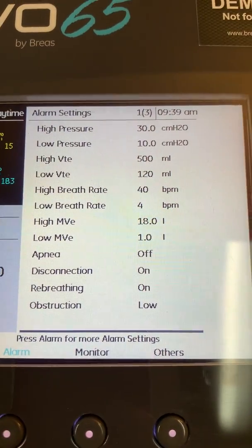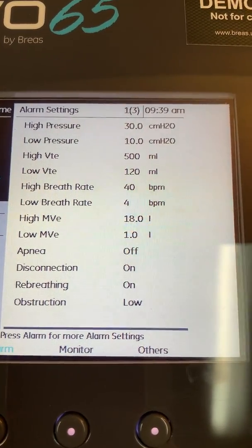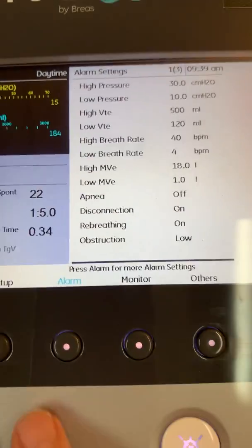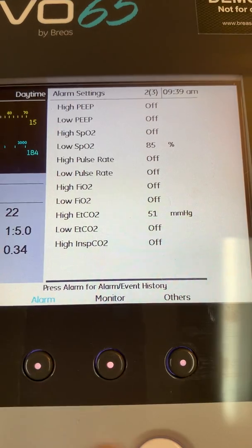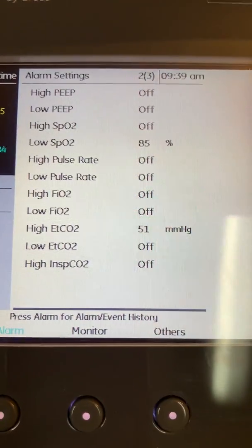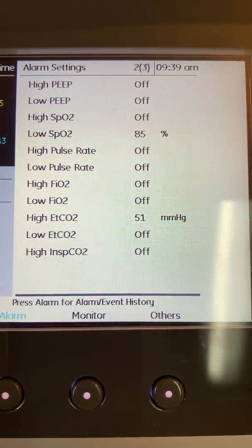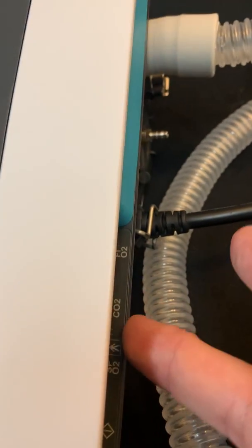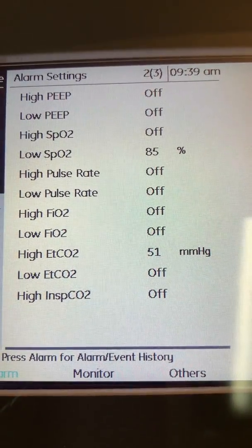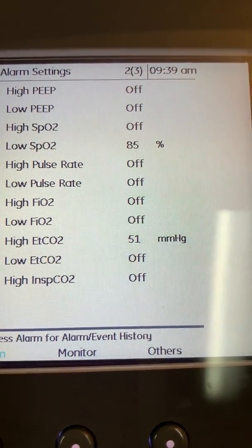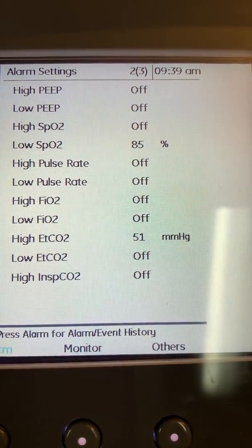This is a quick overview of page one of our alarm settings. To get to page two, I simply hit the alarm button again, which scrolls me to page two. The page two alarms are associated with our advanced diagnostic features — our end-tidal CO2, our FiO2, and our SpO2. You can set high and low values for each of those advanced diagnostics.